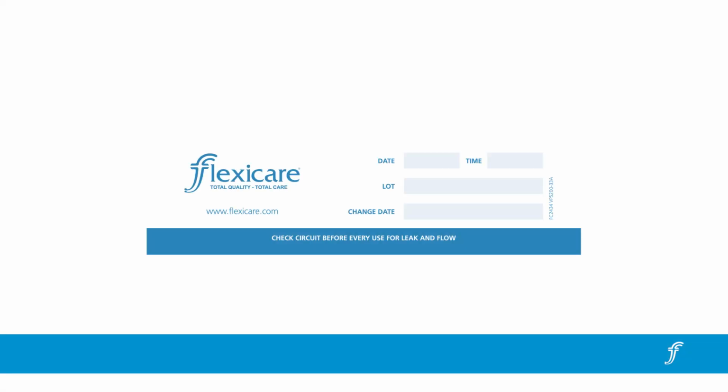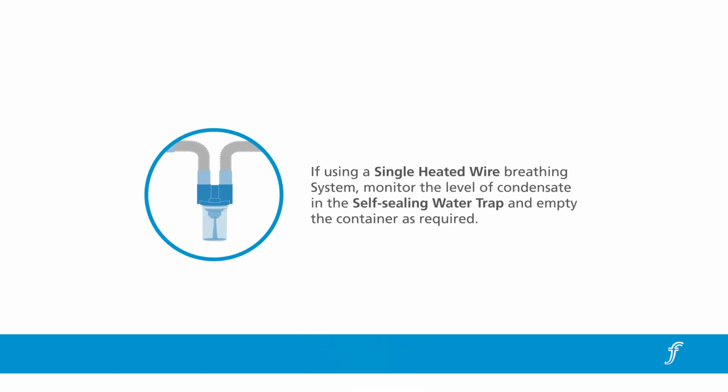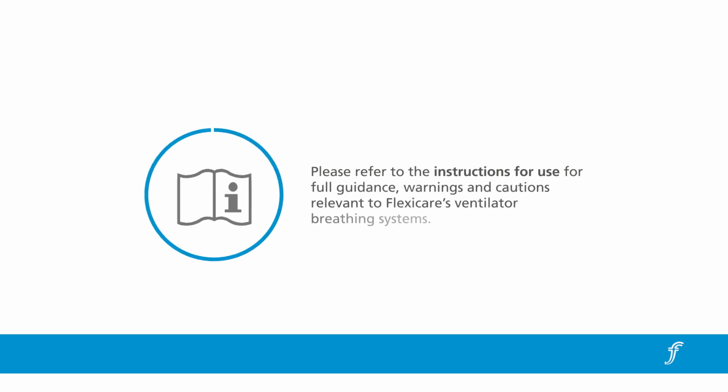Complete the enclosed self-adhesive label noting the date, time, lot number, and change date of the breathing system and attach to the end of one of the limbs. If using a single heated wire breathing system, monitor the level of condensate in the self-sealing water trap and empty the container as required. Please refer to the instructions for use for full guidance, warnings and cautions relevant to Flexicare's ventilator breathing system.